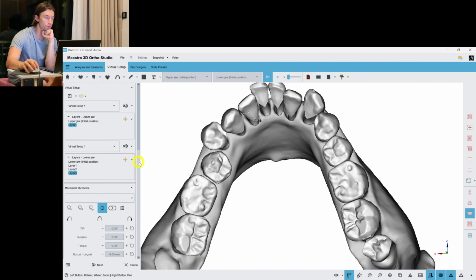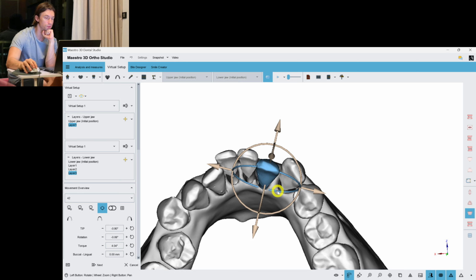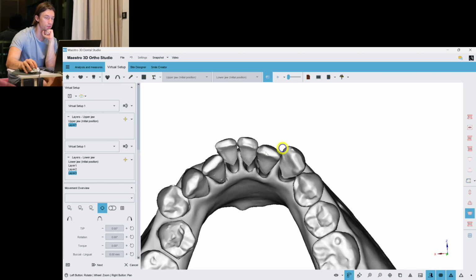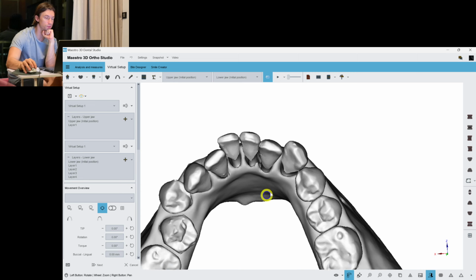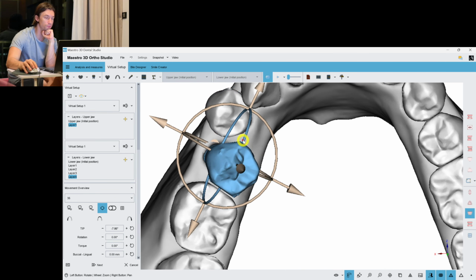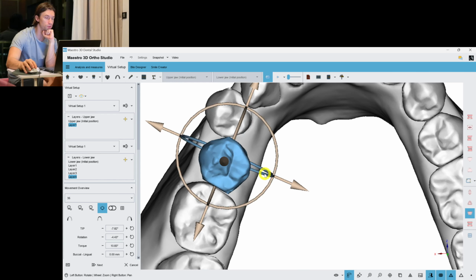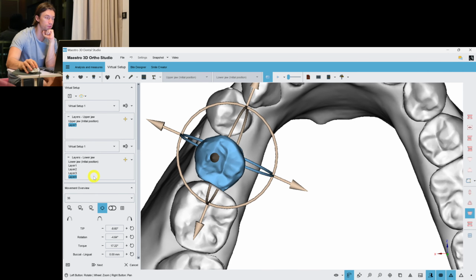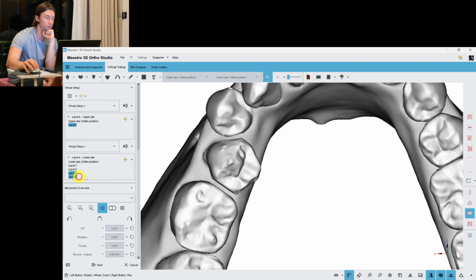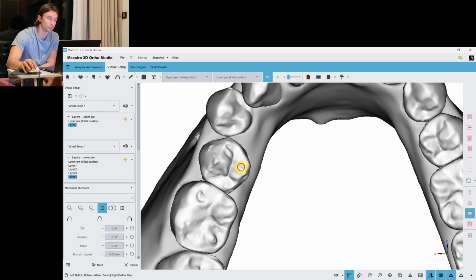At layer 4 we can start moving the first premolar and finish moving the second premolar. I think there is still going to be some IPR here. We will divide this movement to a few stages.